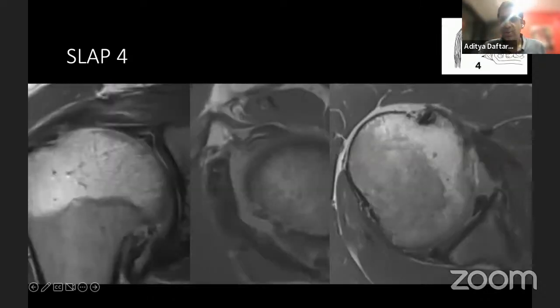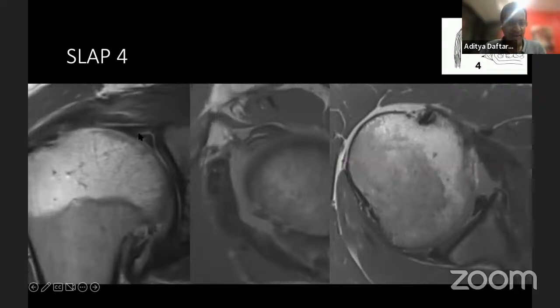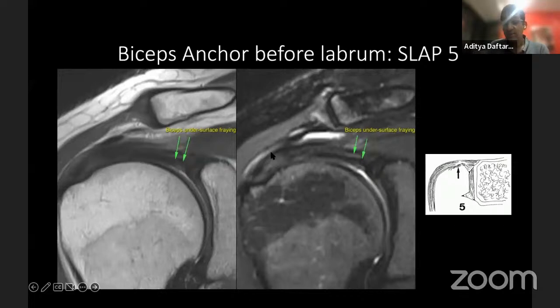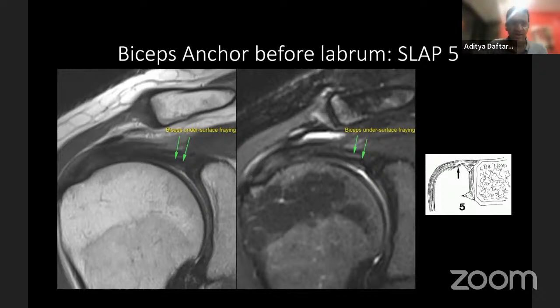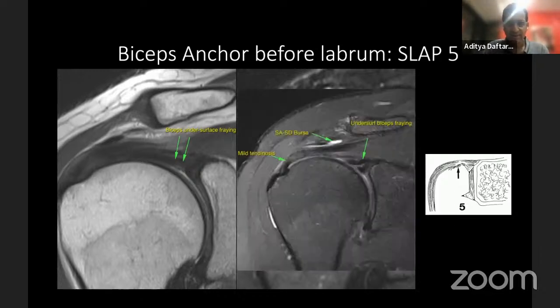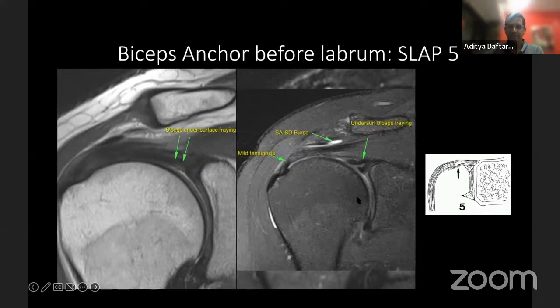A SLAP 4 lesion is one where the labrum has come off but is still dangling off the biceps — there's a remained attachment to the biceps as this structure dangles off the edge. Normally I just report that there's a tear from here to here without specifying the SLAP type. Here's a case of subtle undersurface fraying along the biceps, which would be a SLAP 5 lesion. You can compare normal or slight undersurface fraying to more significant undersurface fraying along the biceps labral junction.